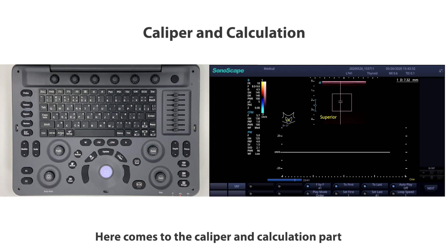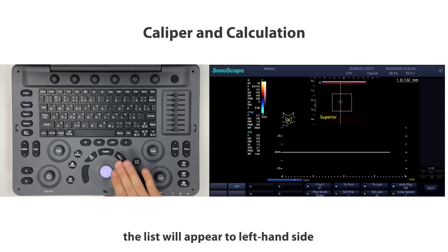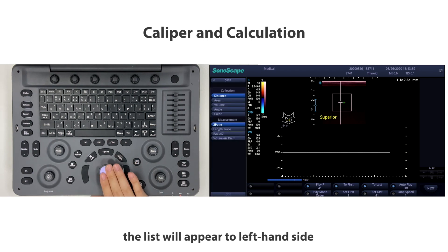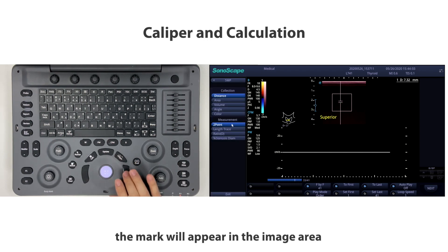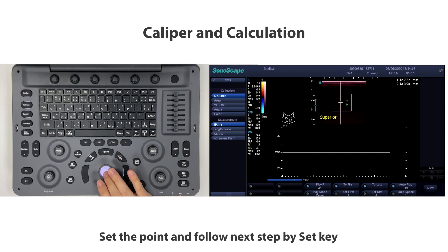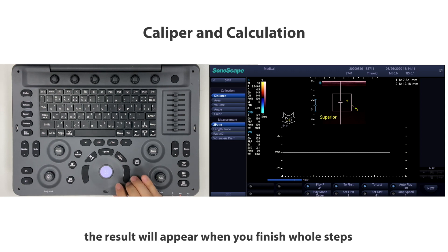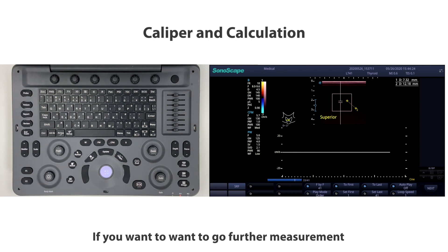For the caliper and calculation section: choose Caliper to do basic measurements — a list will appear on the left side. Click the measurement you need, the mark will appear in the image area. Set the point and follow the next step using the Set key. The result will appear when you finish all steps.